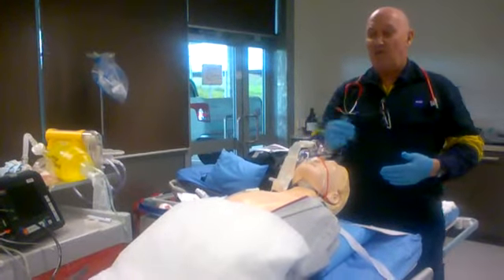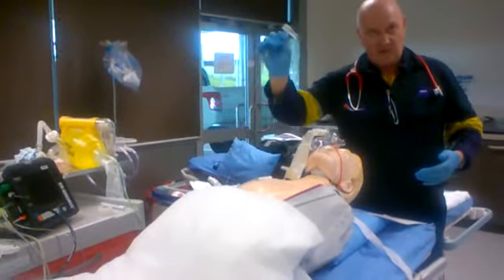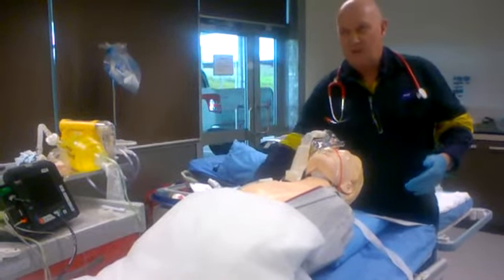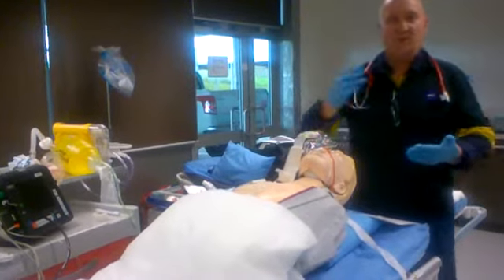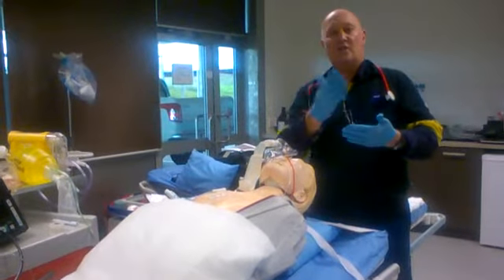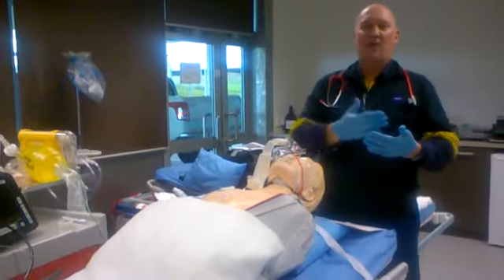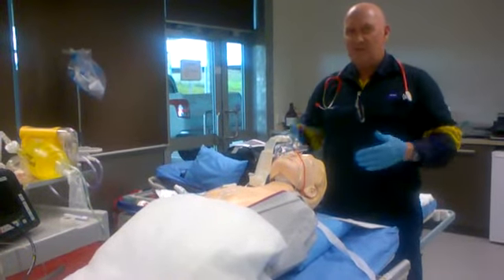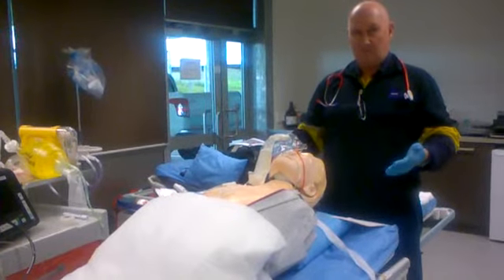We have our end tidal that we will hook up to our ET tube, to our portable capnography and SATS monitor. However, we evaluate the risks: are we in the back of the ambulance? Is it a hostile environment? Are we less than 10 minutes from hospital? Can the patient do that? These are things we have to weigh up before we implement.